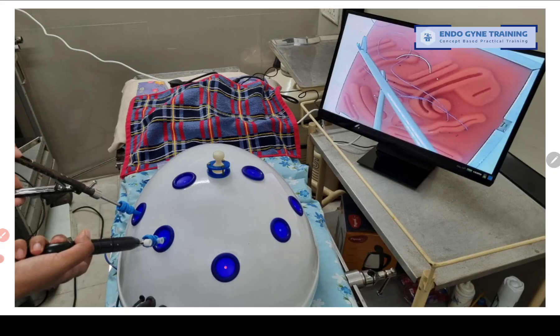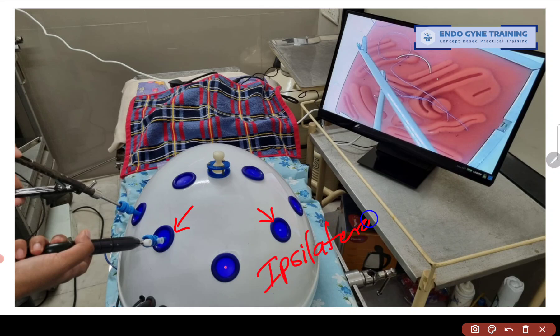This is the kind of pelvic trainer that I have installed in my clinic where we usually train our fellows, and there are a few things to be understood while purchasing one. I am primarily an ipsilateral surgeon, so I am interested in the ports which are on one side of the body — this port and this port. If you are primarily a contralateral surgeon, you would be using this port and this port instead. So first you have to decide what kind of surgeon you are. Most of the concepts I am going to explain are for ipsilateral, and you can extrapolate them to contralateral as well.